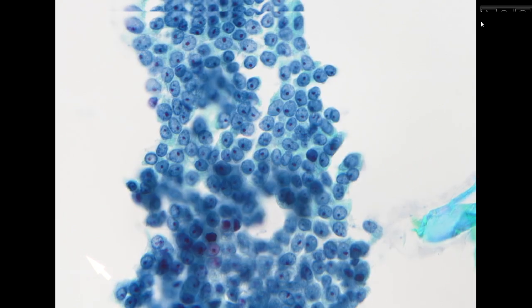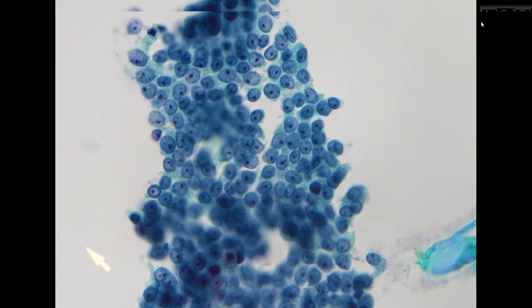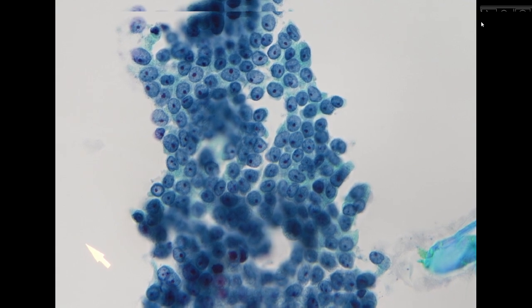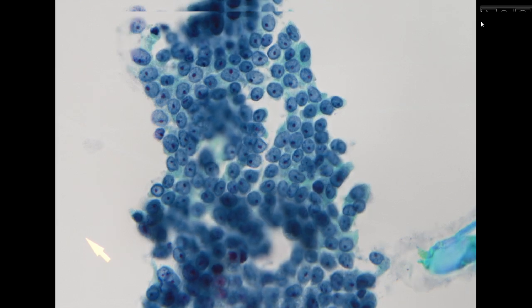This type of arrangement we refer to as drunken honeycombing. Drunken honeycombing is one of the typical presentations of adenocarcinoma of the pancreas.